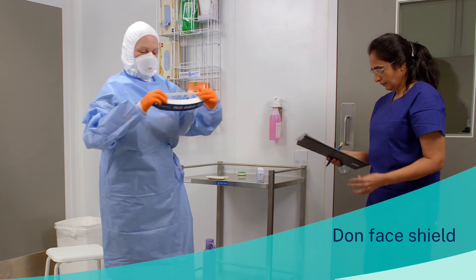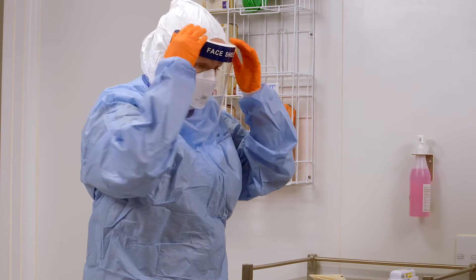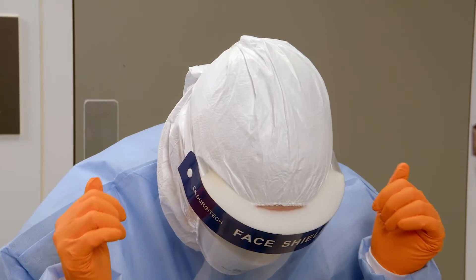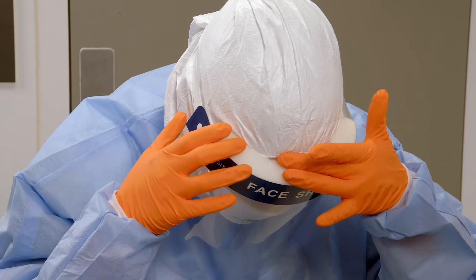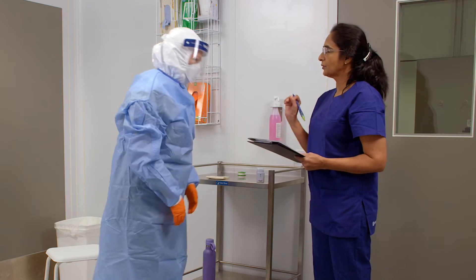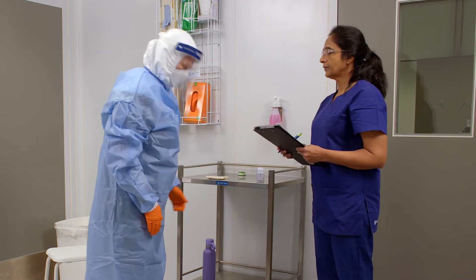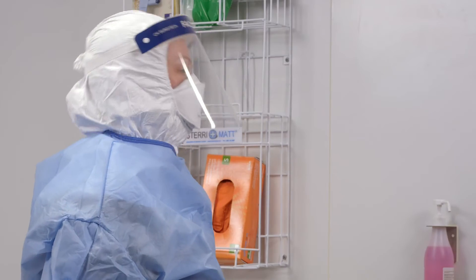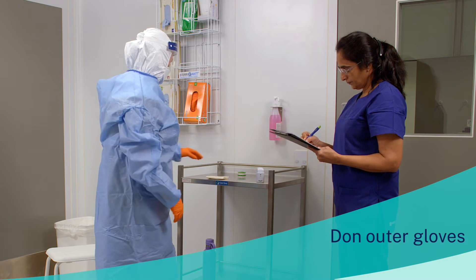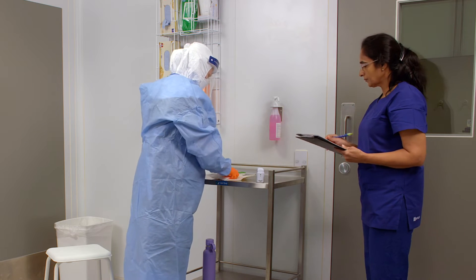Don the face shield. Ensure that the eye protection is fitted correctly and that there are no gaps between the surgical hood and the top of the face shield. Don the outer pair of gloves. These are to be long cuffed to ensure they cover the cuff of the gown sleeves.